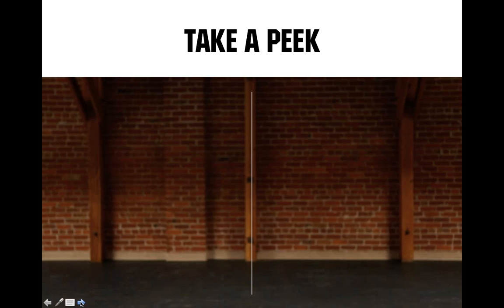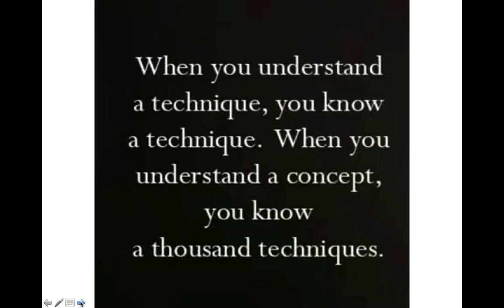What are you trying to do with the tool? And again, it's just a tool. It's all about what we are trying to achieve with the tool. We like to think of this idea of graded exposure. How are we treating the nervous system or the neurosensory system by taking a tool and applying it to skin? And at what rate, at what depth, at what angle, at what vector can help us have some possible positive outcomes for the patient without killing tissue with a sharper edge? And I'll get deeper into that in a second.